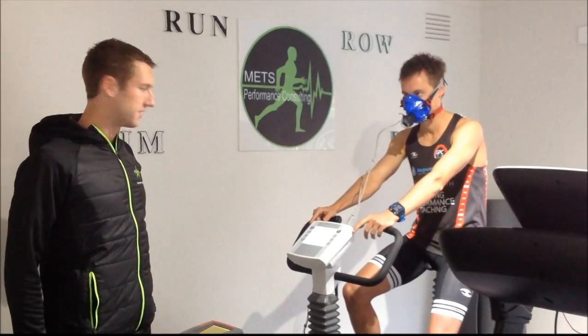What this test actually measures is the total volume of oxygen that his body can take in, transport and utilise in one minute. This is a key performance indicator for endurance events, because the more energy that you can make aerobically, the more power that you can push without getting fatiguing metabolic byproducts.